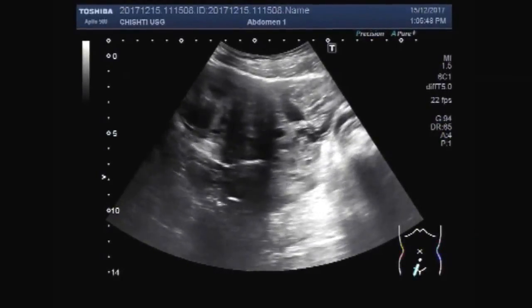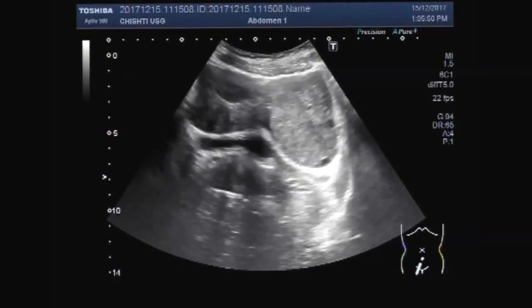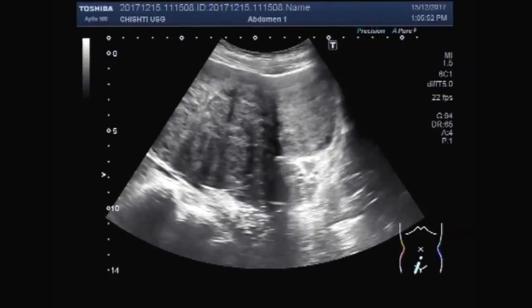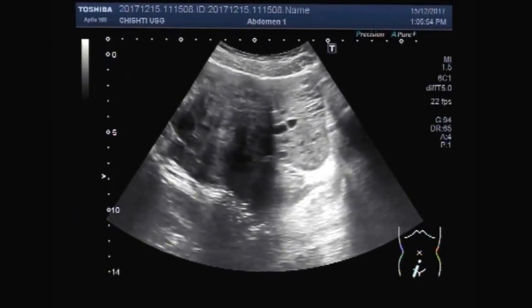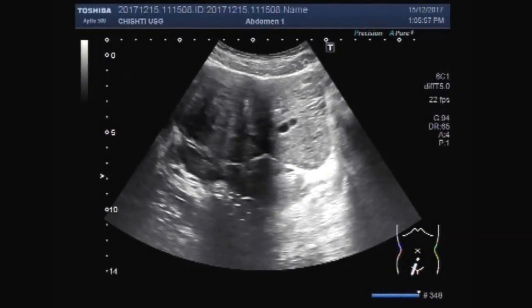Now you can see the right ovary and the mass. The mass is lying just adjacent to the right ovary.